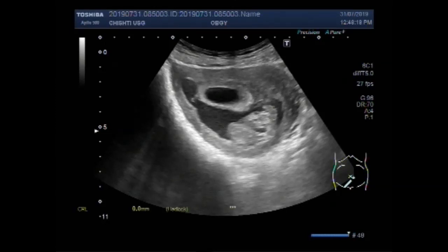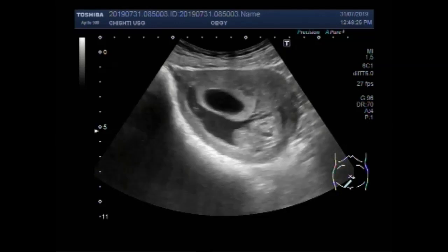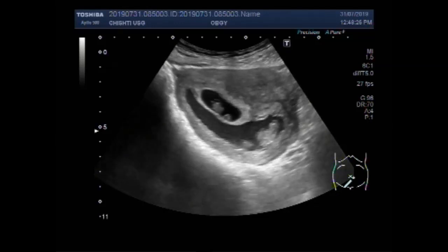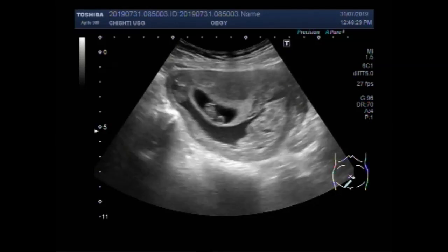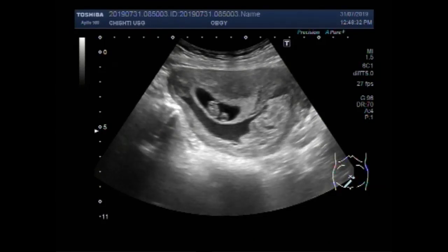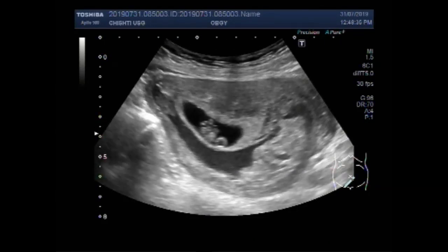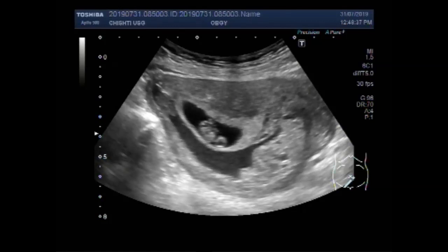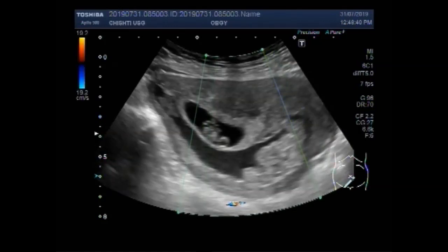The gestational age of this fetus is 10 weeks and 4 days. Now you are going to see the other gestational sac where an alive, viable fetus is seen.